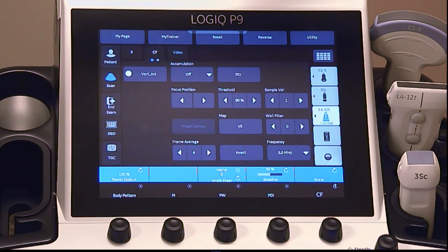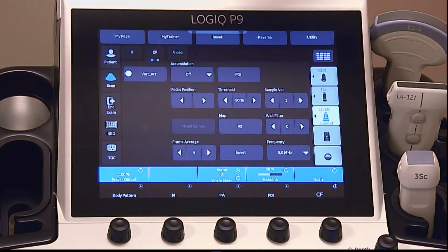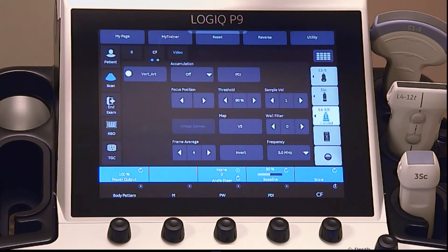The touch screen has many parameter options. Some of the most common options you will adjust in color flow mode are angle steer. The color box provides a Doppler angle suitable for linear probe orientation. You can steer the region of interest, or the color flow linear image, left or right, to get more information without moving the probe.